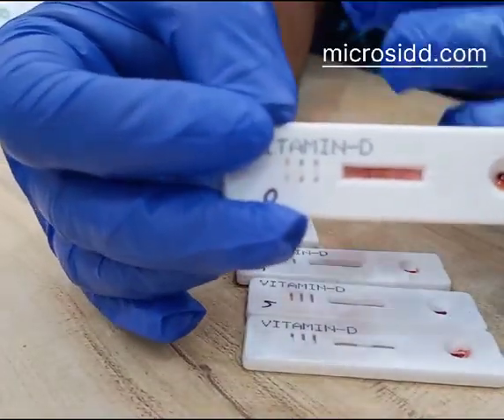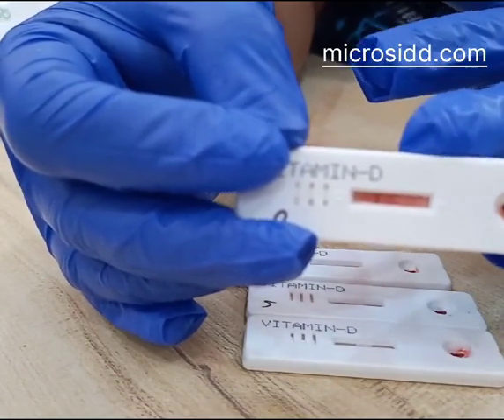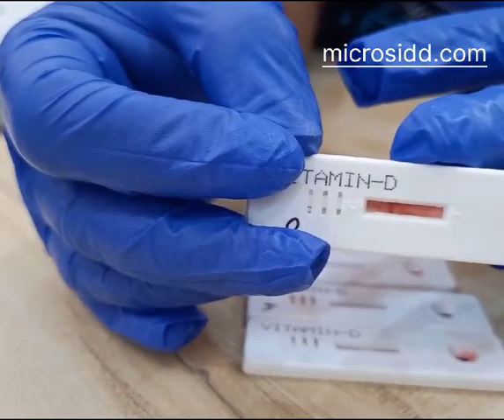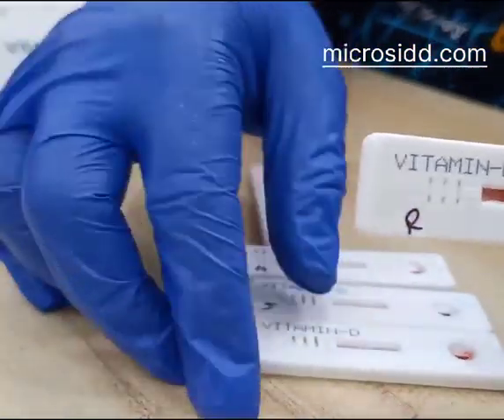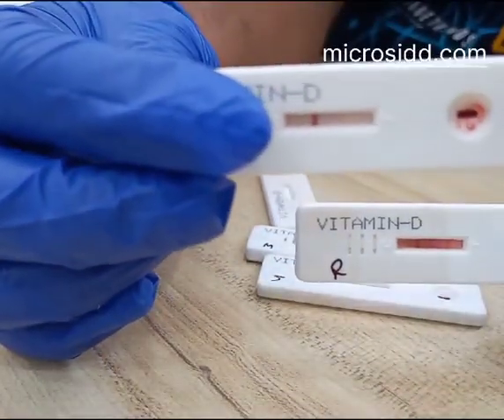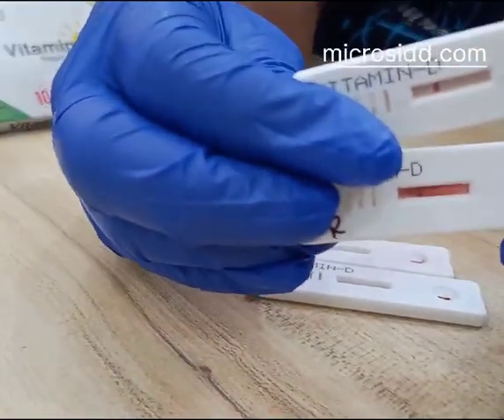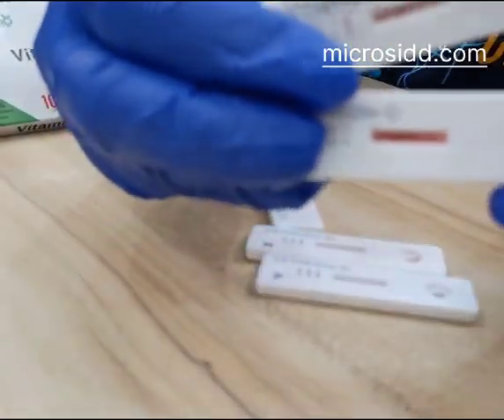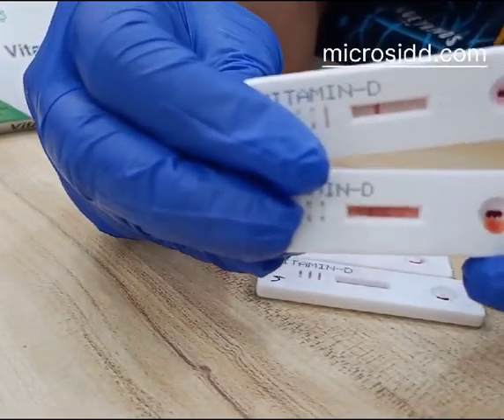This is also the same — sufficient Vitamin D is available in the patient, but because of the higher sample the background has come out this way. With the correct number of sample the test is correct and the background is white. This one has a red background because of the higher number of sample, but no problem.